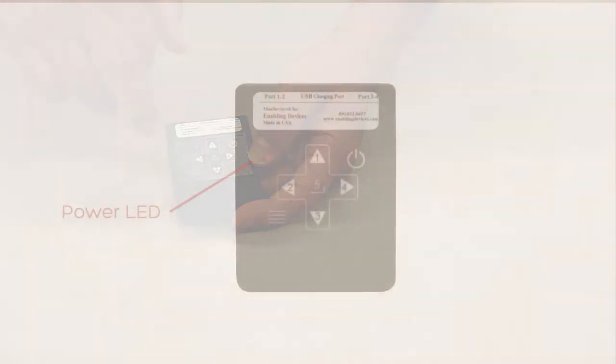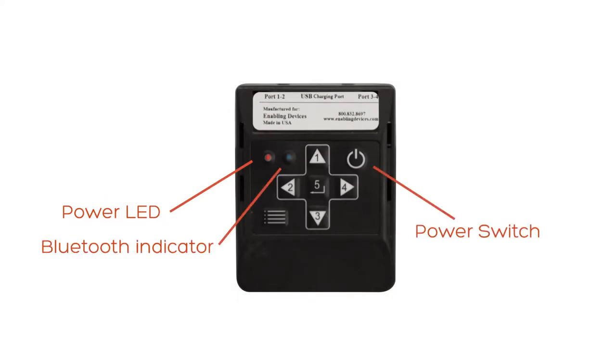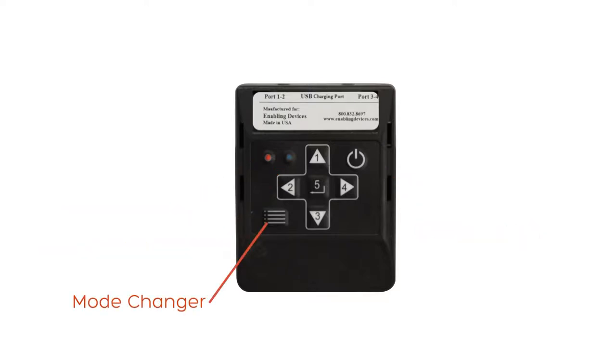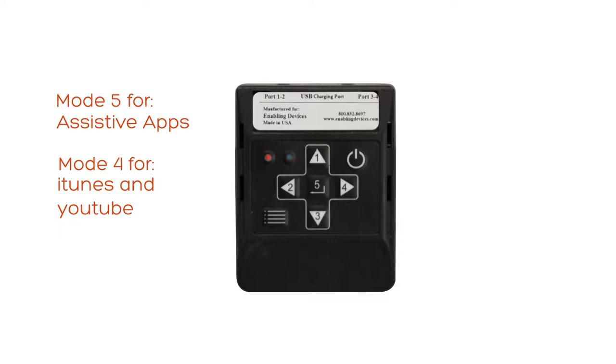Here on the front you have your power LED and also the Bluetooth indicator. Here's your power switch and here is your mode changer. You'll use this when you need to change from the assistive mode which is mode 5 to mode 4 if you want to use iTunes or YouTube. So let's get started and show you how to set everything up.